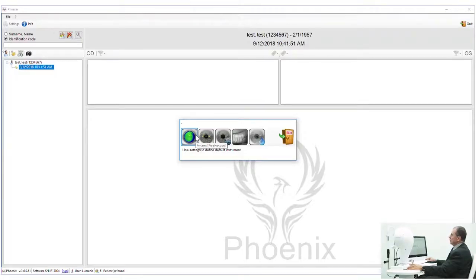The device is a Placido-based topographer using an infrared camera. It is a purely anterior segment corneal topographer, so we don't get any information on corneal thickness or on the posterior side of the cornea.